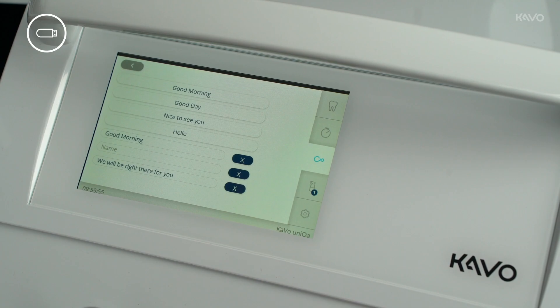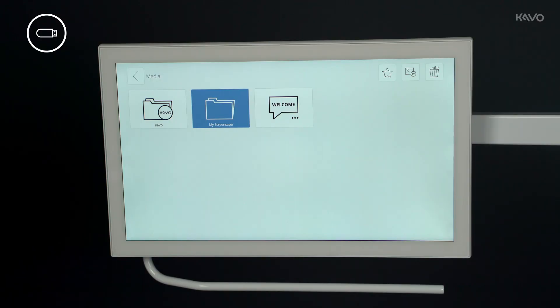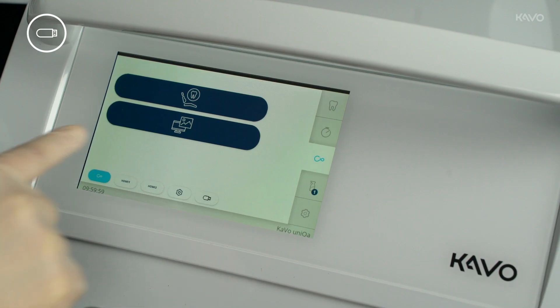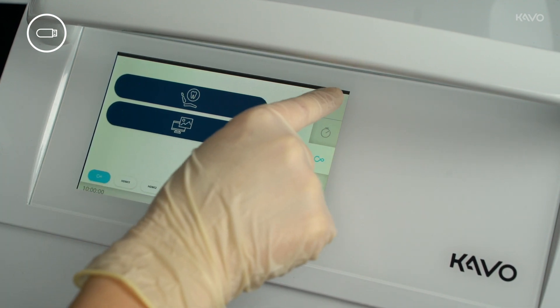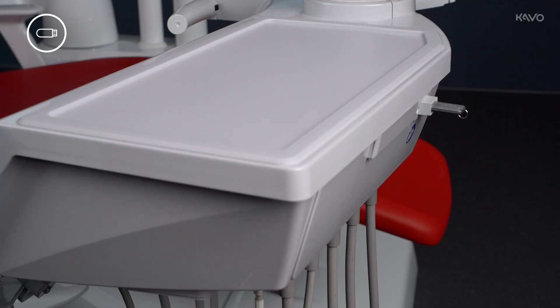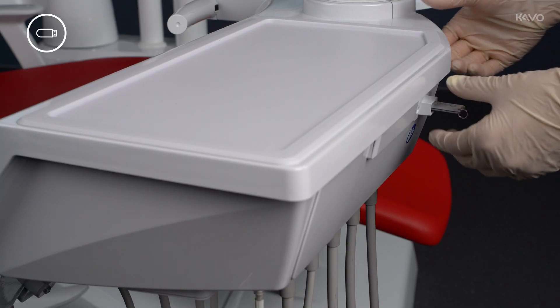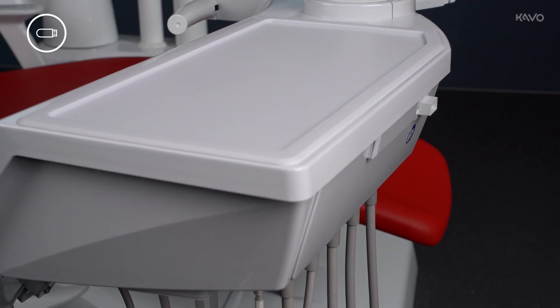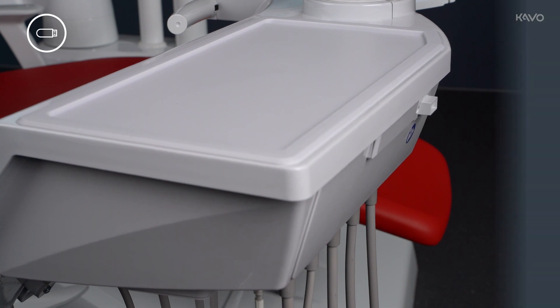If a screensaver is imported, the foot control must be used to confirm whether it should be set directly. The screensaver is activated automatically when the Carvo ConnectBase menu is exited. Remove the imported media from the USB stick again to avoid a renewed prompt the next time the USB stick is inserted.